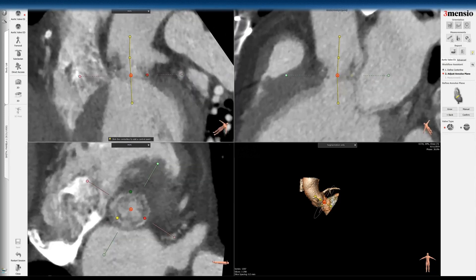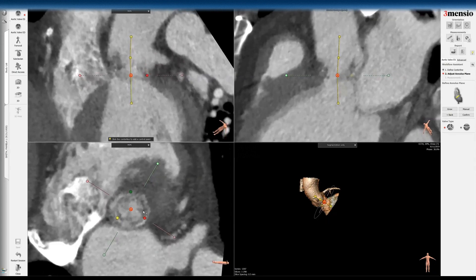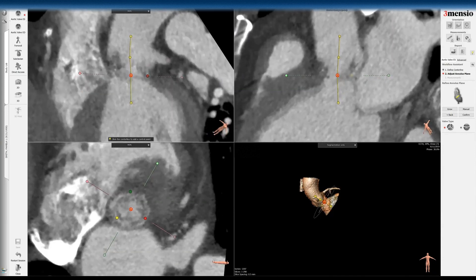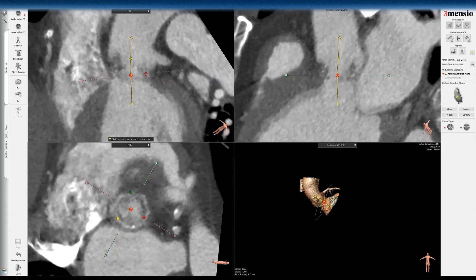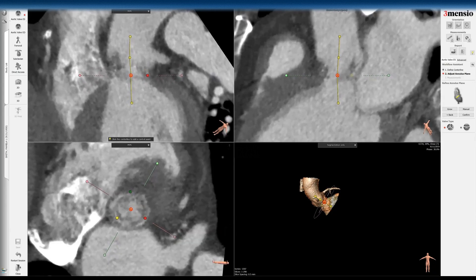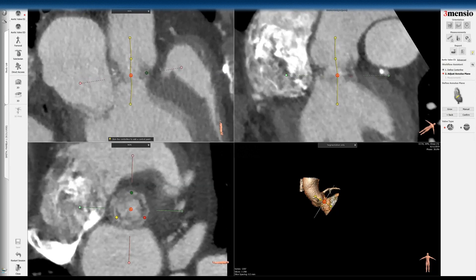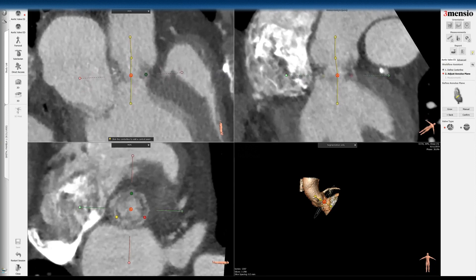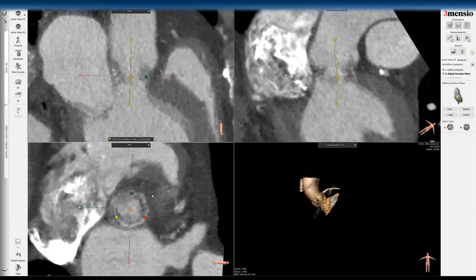That faint signature is at the base. You can see the line going all the way at the base — down to the right cusp as well. Now this line is actually a little squiggly; it's not a plain flat line. So you have to be mindful of that when you do your workup.